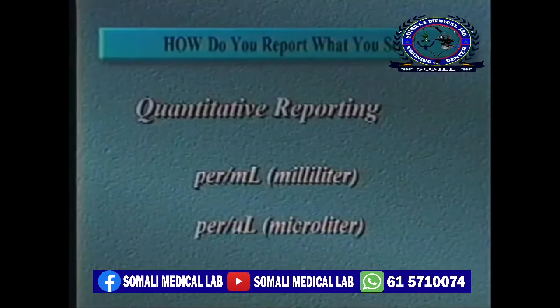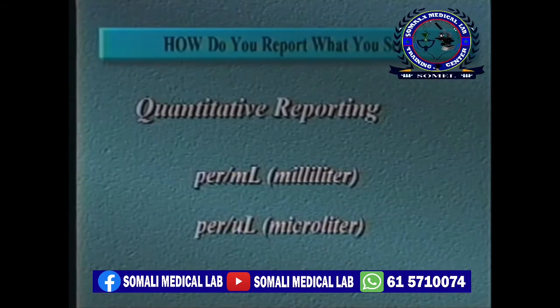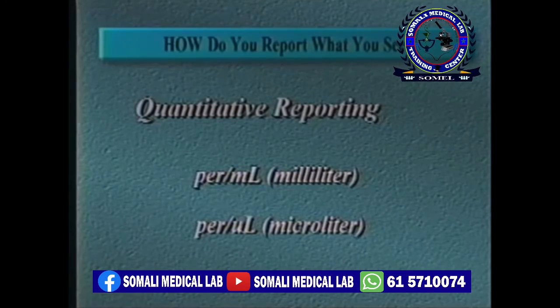There's a movement afoot to report urine microscopics in a more quantitative fashion than our current ranges. Some standards suggest reporting microscopic elements as number per milliliter. Others are recommending numbers per microliter.